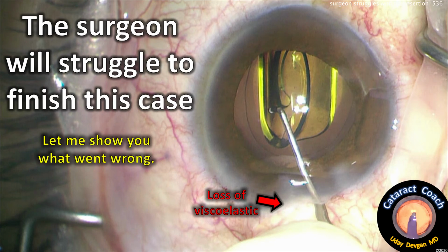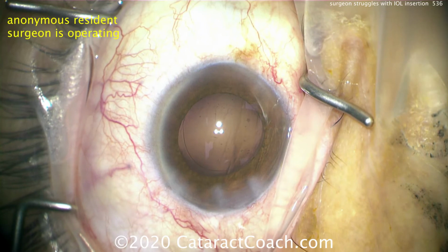cataractcoach.com, the surgeon will struggle to finish this case. Let me show you what went wrong. Part of it is that loss of viscoelastic.